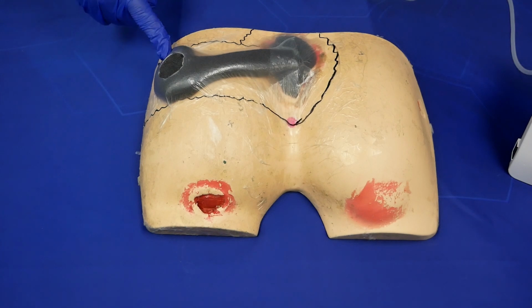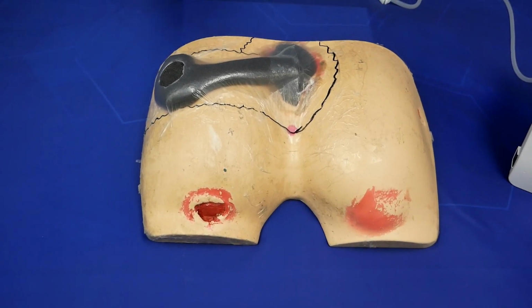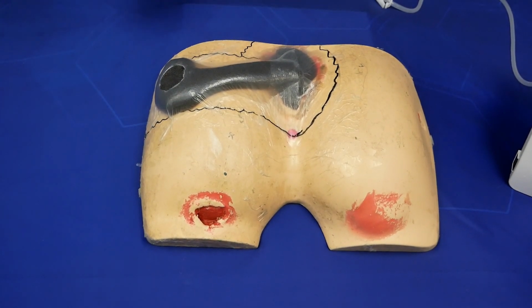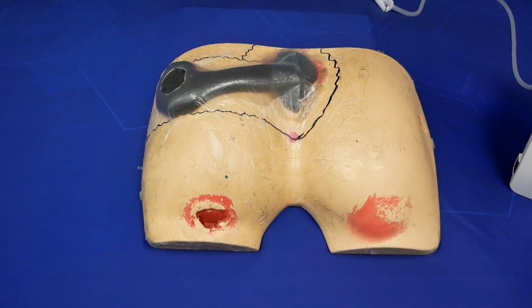And I like doing the landing spots for our port pads because it allows us to have enough room to cut the correct size hole in our dressing, but it also allows the port pad to rest on there like a pillow or a platform to protect the skin from any further indentations or irritations.